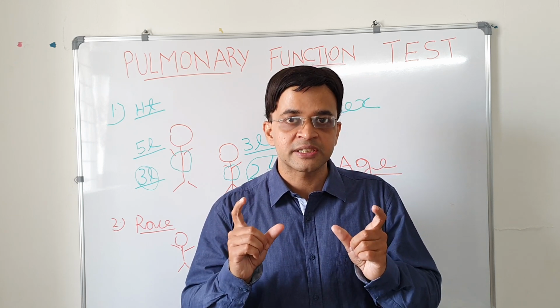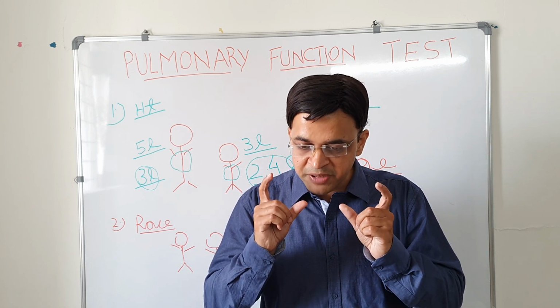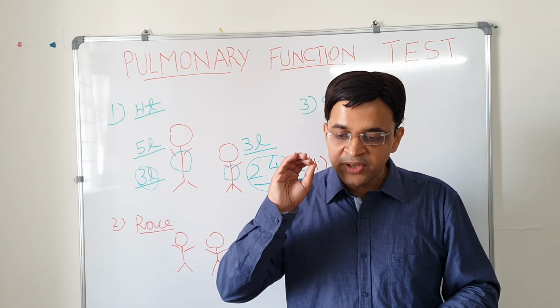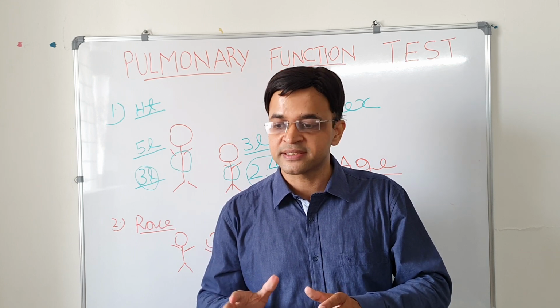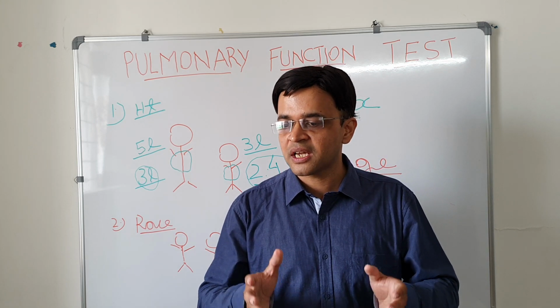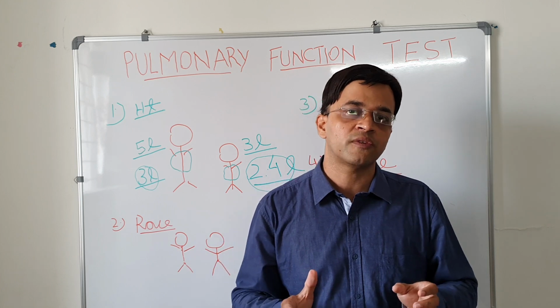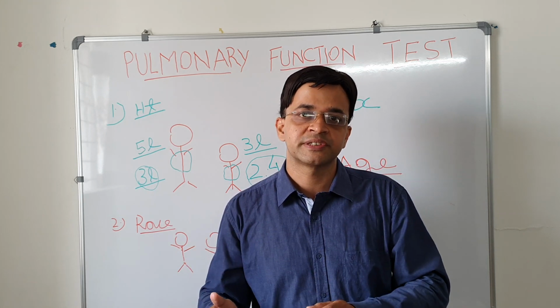we will discuss later, but before that, there is something peculiar about pulmonary function test which separates it from other modalities like ECG or echocardiogram or any other values. The reference range of the values obtained in pulmonary function test keeps changing for each person.